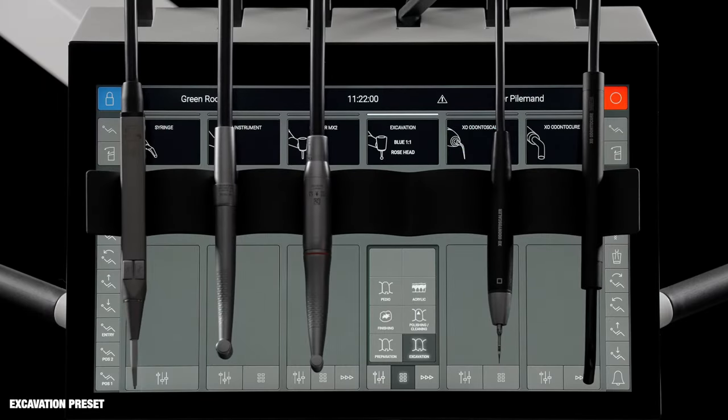The operators are instructed to fit a blue contra-angle with a rose burr on the micromotor. When the foot control is activated, the burr rotates with a constant low speed of 2000 RPM, optimal for removing decayed dentine.